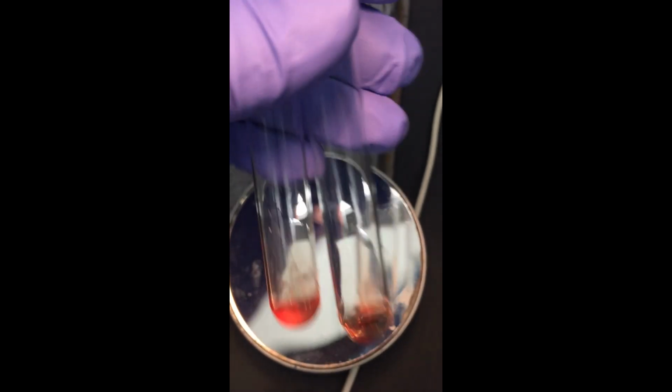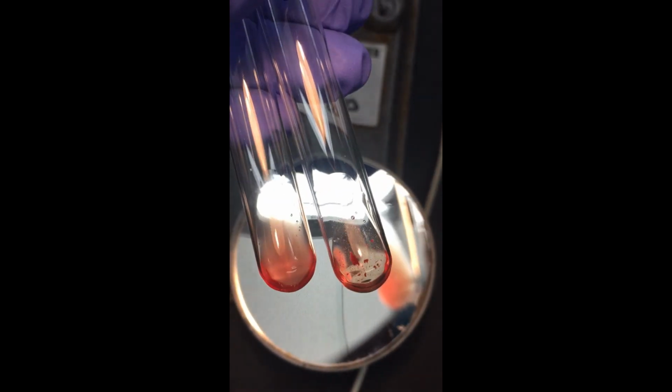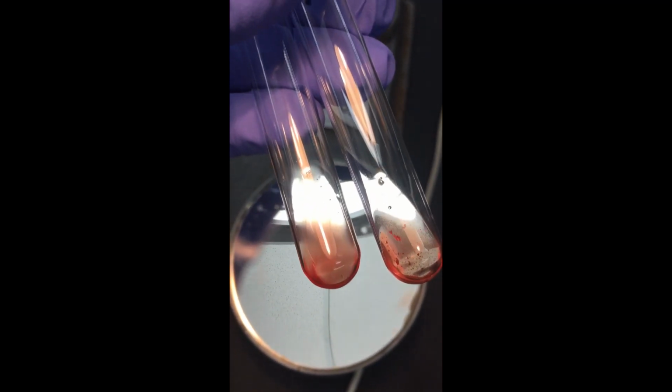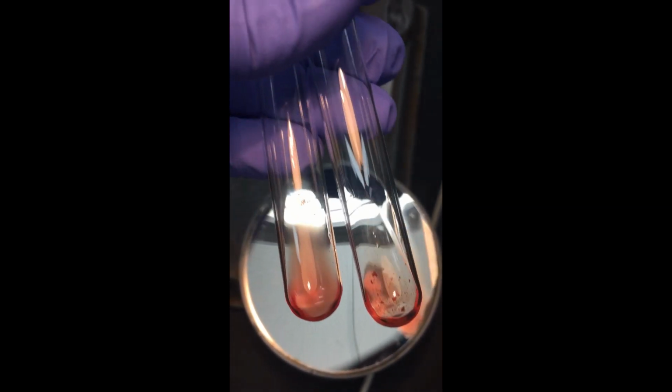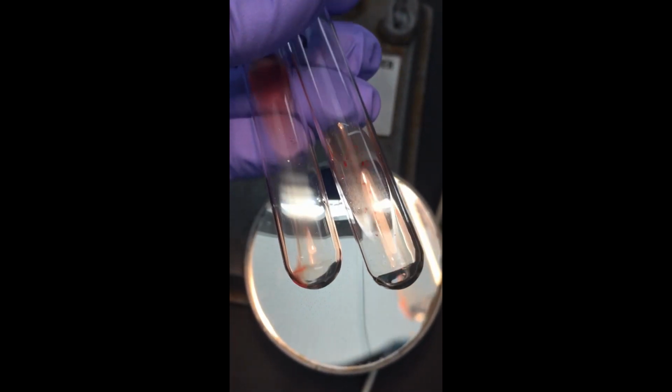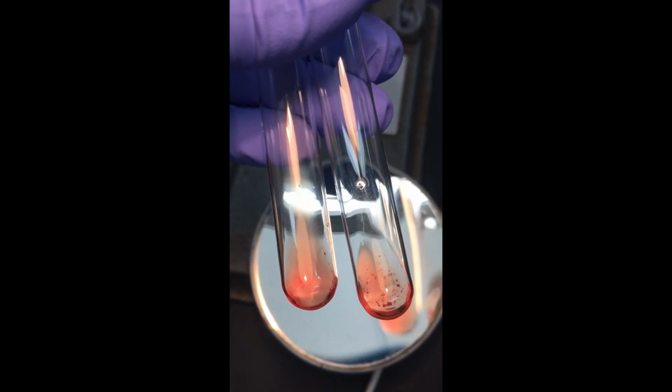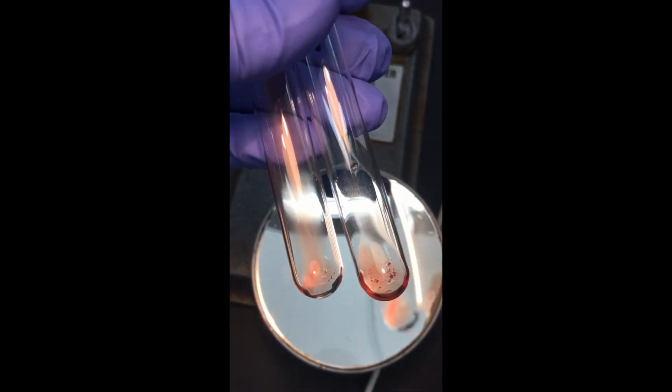Tubes 3 and 4. Remember what we're testing for. We're looking for antibody in our patient's serum. Okay. Tube 3 is on the left, tube 4 is on the right.